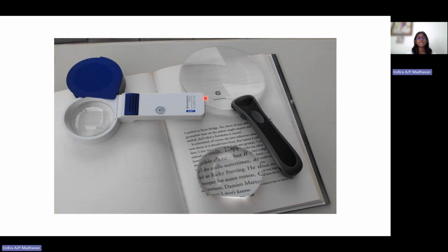Okay, the first one is the handheld magnifier. So these are the types of handheld magnifier that we have. Not this, yeah, these two. This one is the illuminated handheld magnifier, and this one is a similar version but without the lighting, so the non-illuminated handheld magnifier.